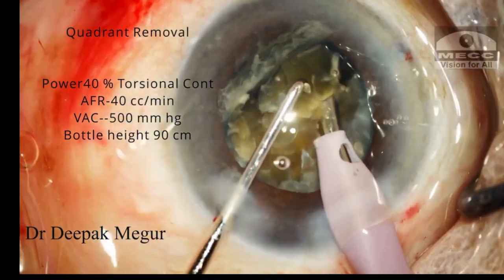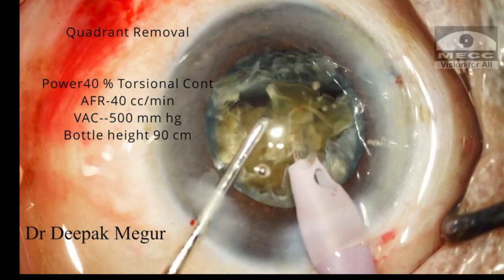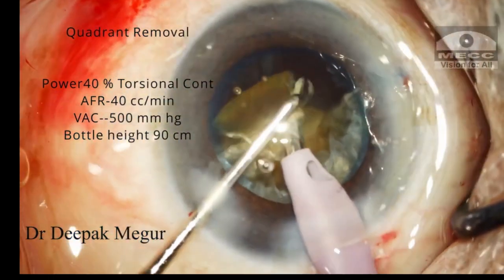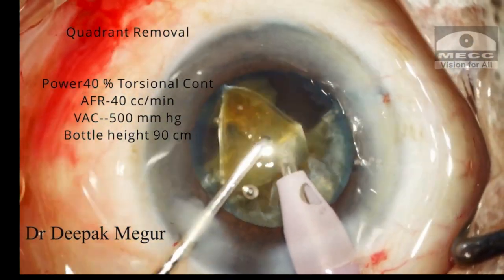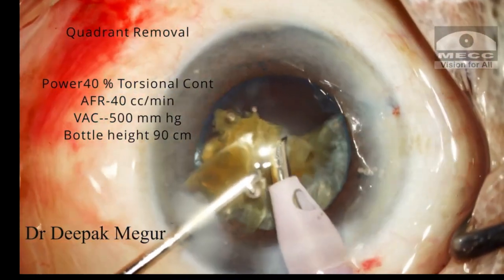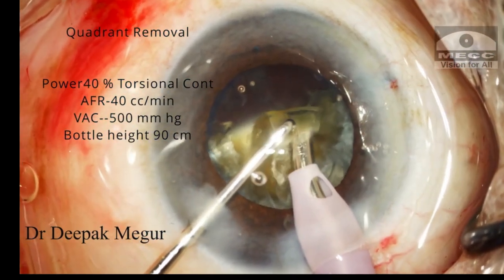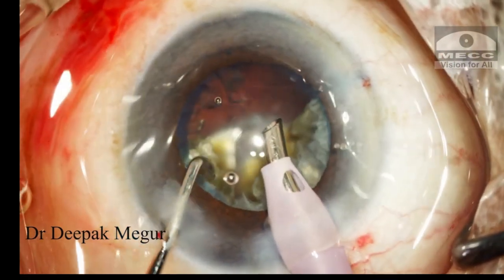It's mandatory for us to ensure that the plane of emulsification is at the level of the rhexis or at the level of the iris. To control turbulence, we must always have just the right amount of power coupled with the appropriate flow rate and vacuum for that particular machine, so that all the small fragments are emulsified in a very controlled manner without any of the fragments flying around and hitting the endothelium.